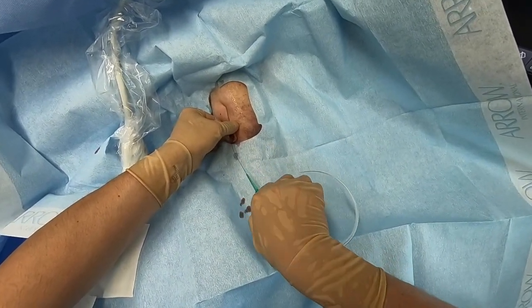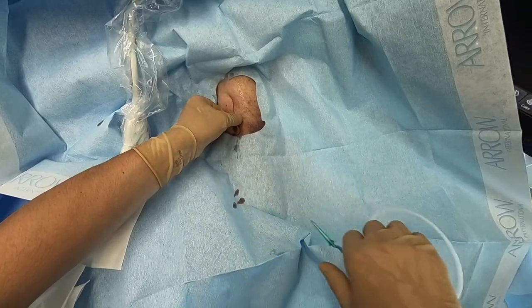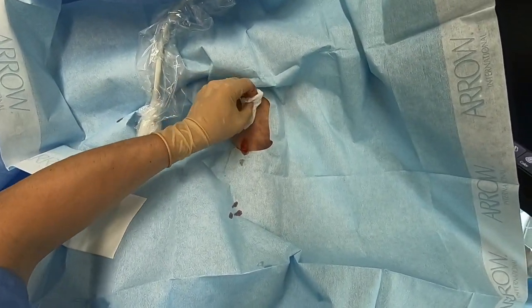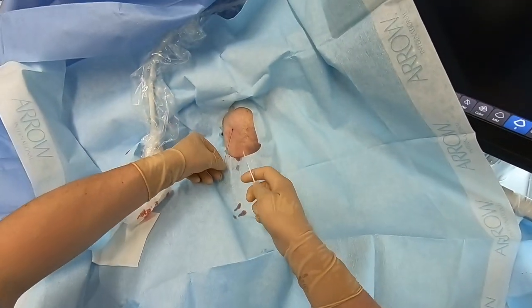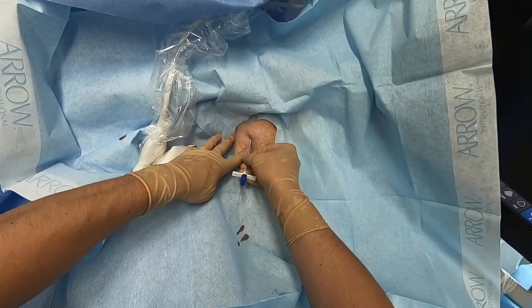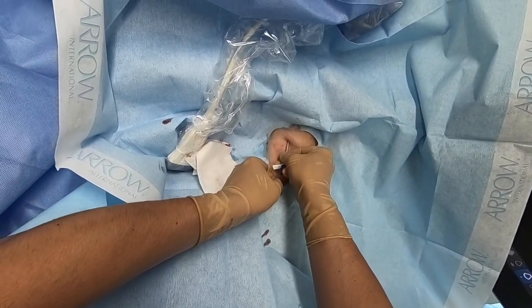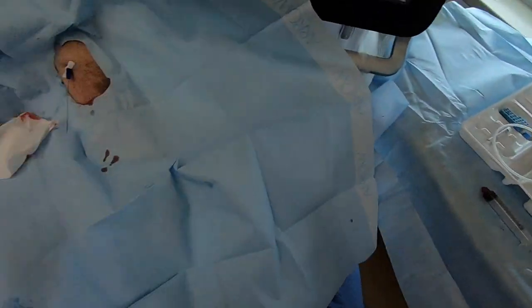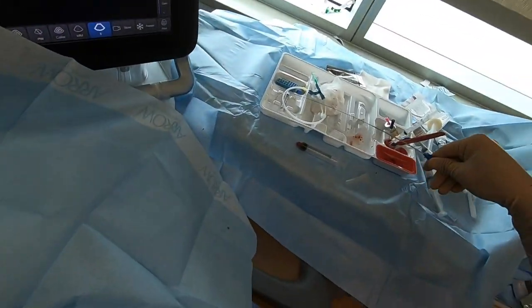We're going to try again with the wire. Generally like an IV, this is easier with a tourniquet on the arm, and sometimes the wire will hang up on the tourniquet, but usually will still pass. You can always have someone drop the tourniquet if need be. Wire passes pretty easily, so the needle comes out. We can now pass the combined dilator sheath — no skin nick is generally needed, though occasionally a tiny one may help. This passes pretty easily and dilation is similar to other dilations. Holding quite close to the tip, not high up, with a little countertraction on the skin, then the hand goes to the wire, and we continuously rack it back and forth as we advance the dilator, confirming it moves freely and is not kinking. Advance it all the way to the top. To set up the peel-away, we twist the core 90 degrees to unlock it, then remove it and the wire simultaneously.